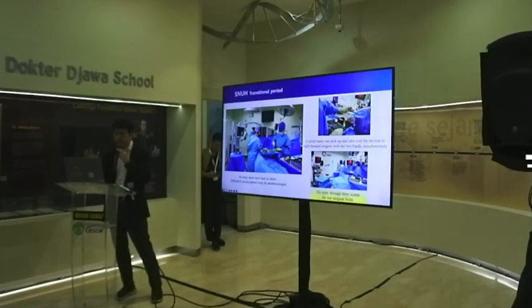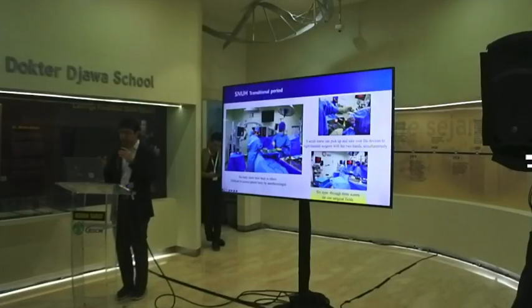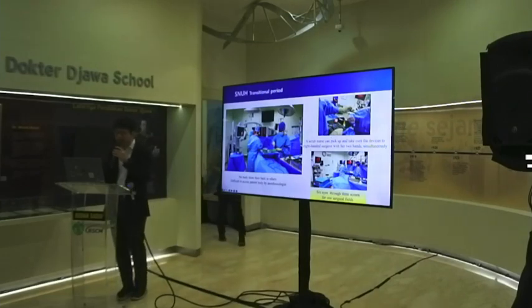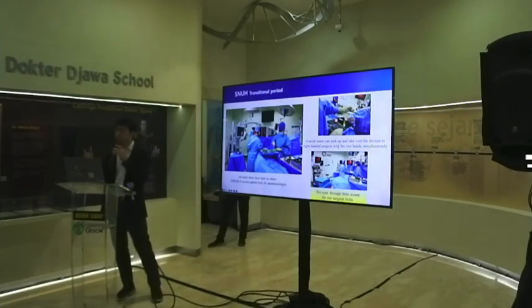But in the middle of the period, Professor Kim changed the setup, because in the linear setup they have to show their backs, which can cause contamination. In the face-to-face alignment, the scrub nurse can pick up and hand over instruments to the right-hand surgeon. Most neurosurgeons are right-handed, so with the scrub nurse and neurosurgeon face-to-face, it is much easier than the linear alignment.